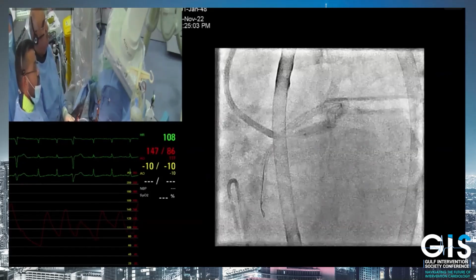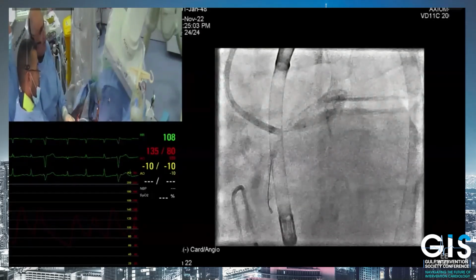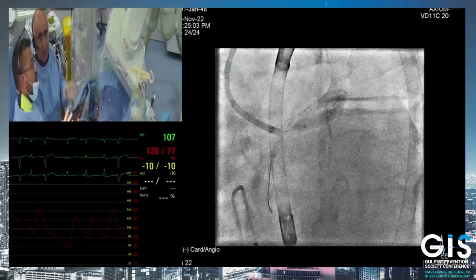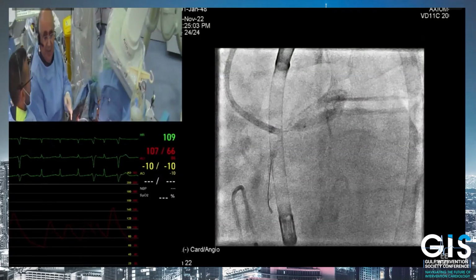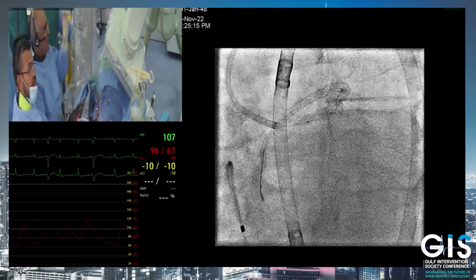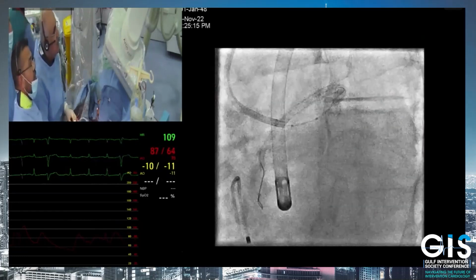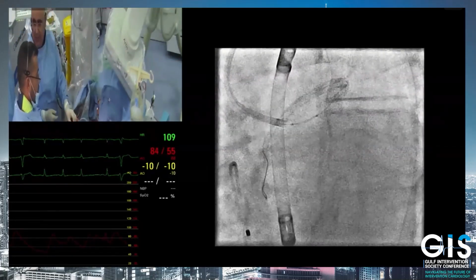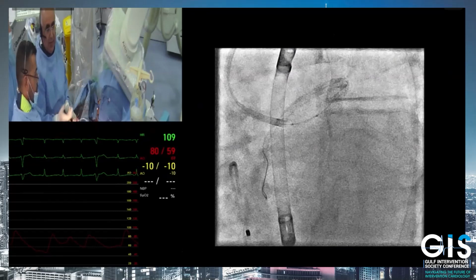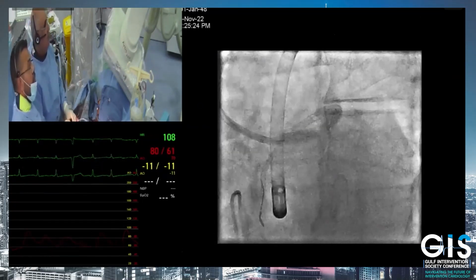What's the size of the balloon? 5.12, 5.10, sorry. 14. Okay, down. Yeah, 10. My dear, I'm asking about the size of this. You are pointing. I say, what's the size? And they show me 10. So I don't know what is going on. No, it's a 5.12 balloon. Again, please. It's a 5.12. Yeah, that's what I'm saying. Okay, good. Go to 16, please. 18. Okay. Down, please.